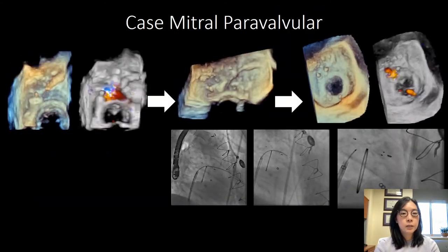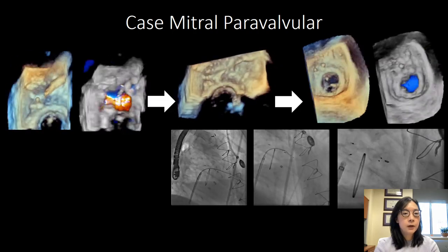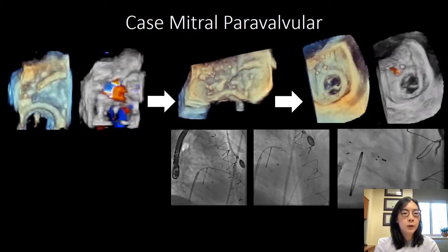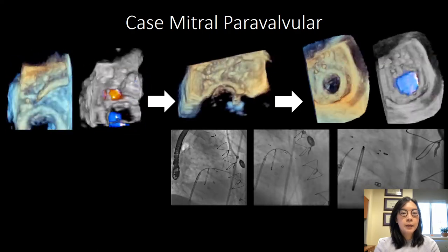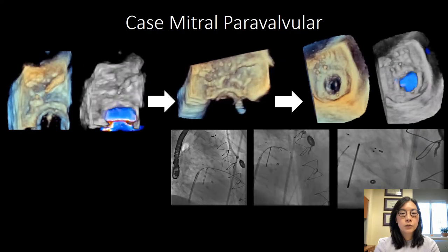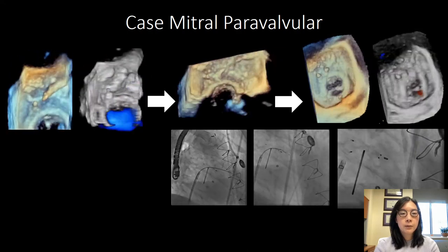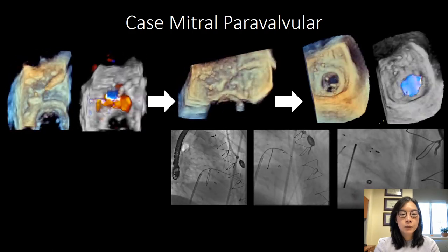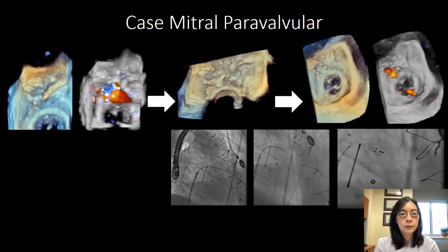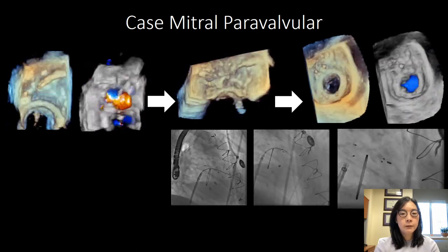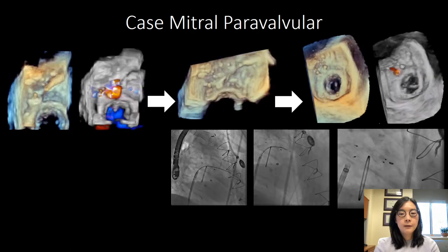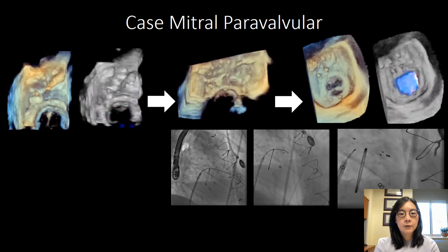Here is a series of images showing his procedure. The top left images with and without color show the catheter and wire as we cross next to the original device. The wire has gone through on the middle image with the original device still in place. The top right image shows two devices now at the 11 o'clock position, with still some residual jet from between the two devices but less significant than before. The bottom row of fluoroscopic images matches the TEE images — the leftmost showing the wire crossing the paravalvular leak, the middle showing deployment of the second device, and the rightmost showing both devices in place after release.